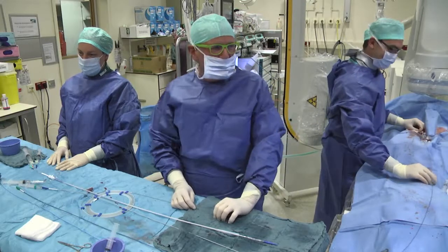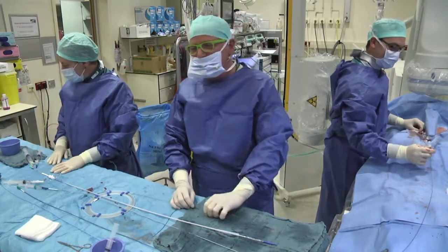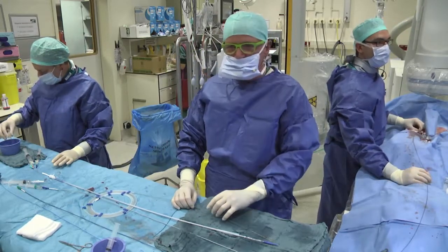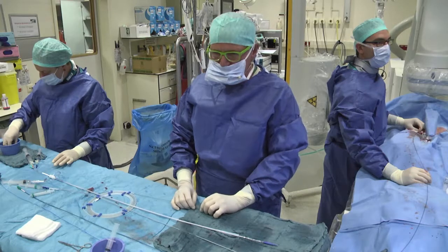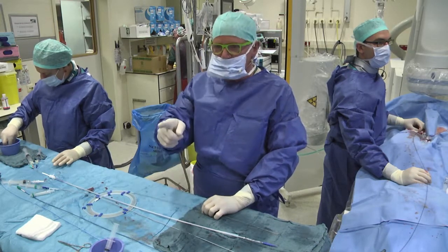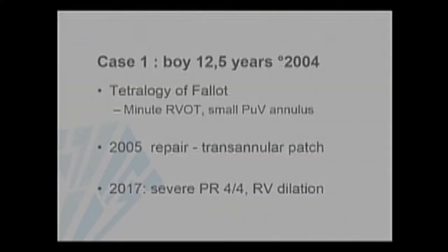We have 3 cases today. The first case will be putting in a valve in a patient after tetralogy of Fallot, but we prepared a small presentation, so allow me to walk you through the presentation first. So first case is a boy.